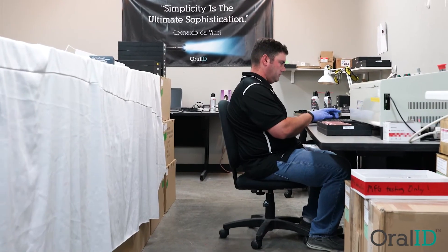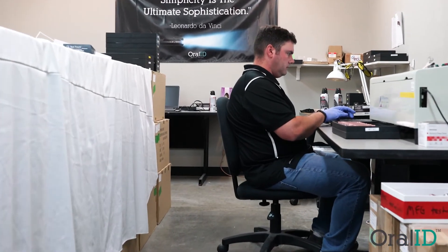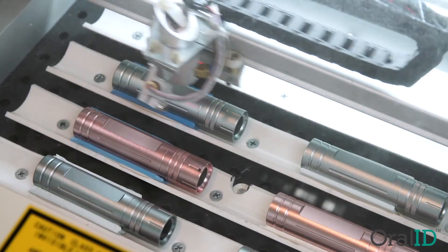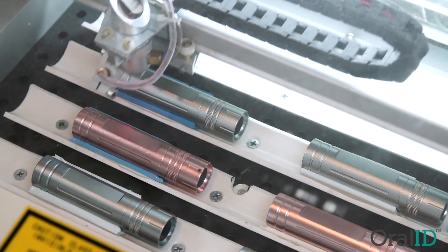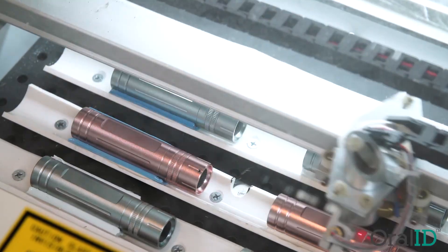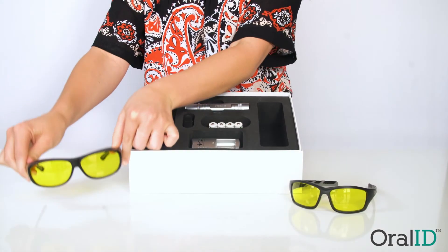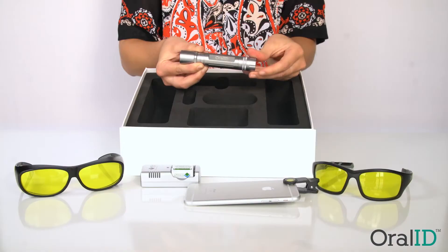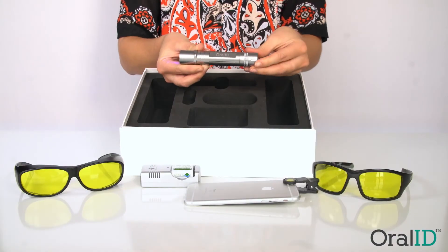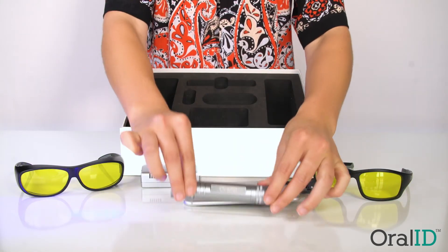We designed Oral ID to be the simplest oral screening device on the market. Just put on the eyewear and press the power button. It's really that simple.